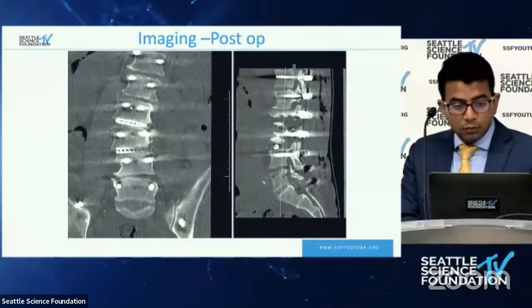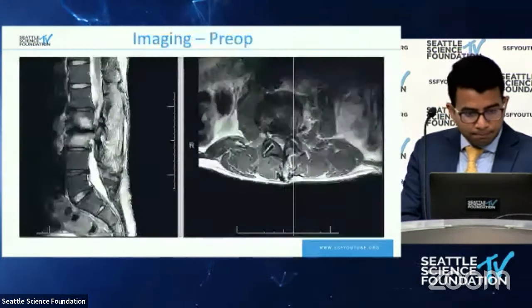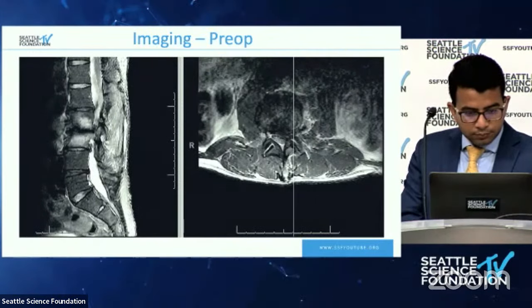You know, in my practice, obviously everyone's different, but I do a lot of laterals, and you know, the plexus is always an issue, and this guy developed some weakness post-op, and he actually was weak before surgery. I don't know if you guys saw that L2-3 level, but it was pretty collapsed. Yeah. And so he progressed pretty significantly.